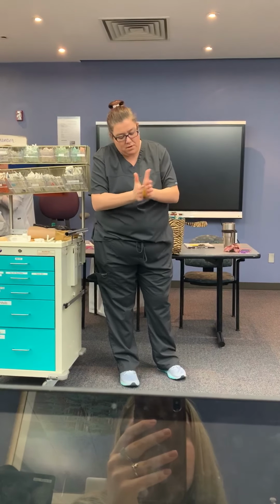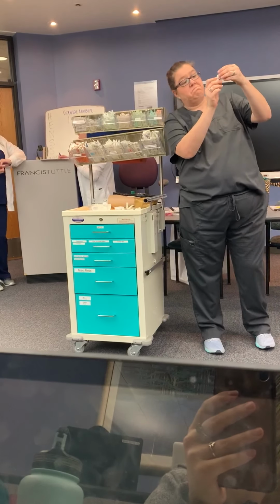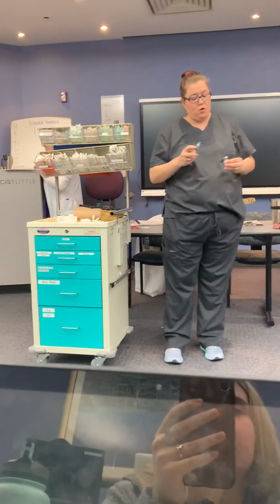I'm going to guess this probably isn't going to be perfect since it's not really Rocephin. Not bad. Okay, so now we're going to go back in.